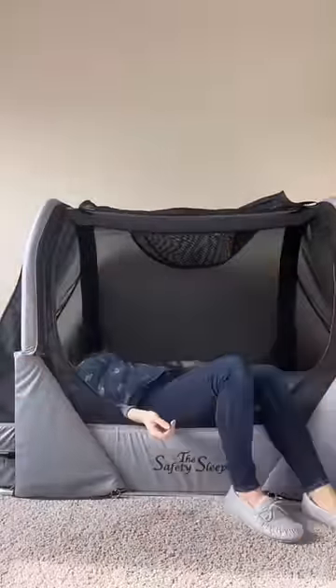Then you just keep zipping, and you have to thread the zipper back down through and velcro it up so he can't get to it. I truly love his bed. If you're interested, please check out my link in my bio for a discount. The safety sleeper bed is truly amazing.